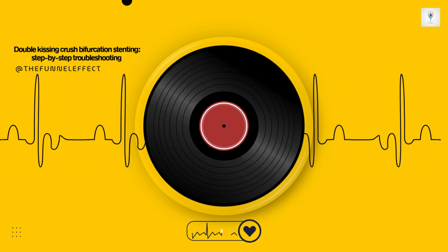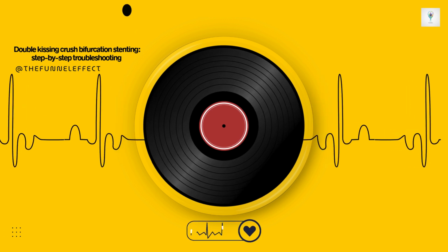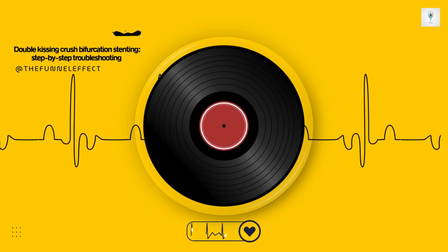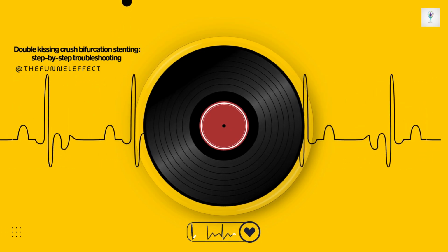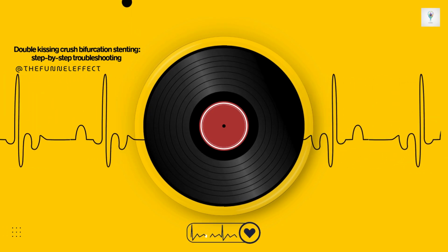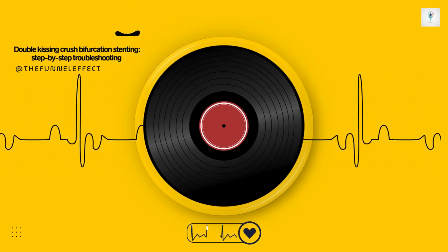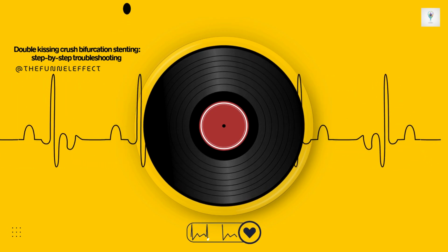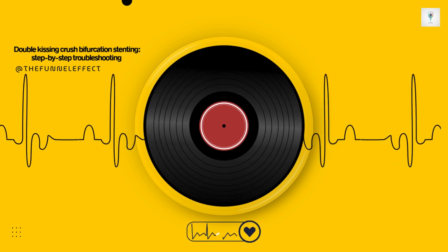But isn't there a risk of damaging or even breaking that jailed wire when you inflate the crushing balloon at high pressure? There absolutely is a risk, and wire choice is paramount here. The studies cited in the source looked at this closely, and the findings are clear. Polymer-jacketed guide wires, those with a smooth plastic coating, seem to tolerate jailing very well. Damage was seen in only 2 out of 115 cases in one study, and it was mild. Compare that to non-polymer jacketed wires, the standard metal ones. They showed damage in 55% of cases, including internal fractures, meaning the core of the wire broke. So the bottom line is, if you're going to jail a wire during the crush, it really should be a polymer jacketed wire.